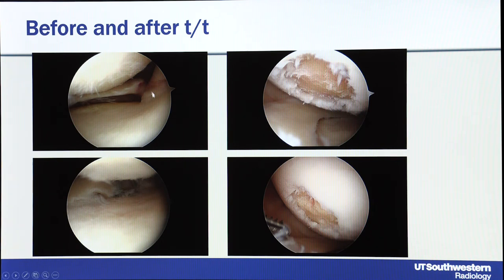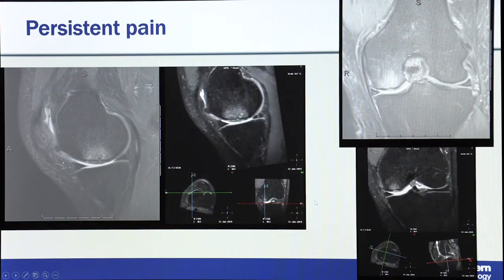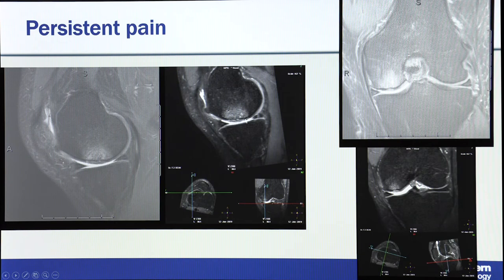Here is how it looked on arthroscopy before and after treatment. There was a posterior root tear being repaired and hyaline cartilage damage in that area. After shaving and microfracture, the patient presented with persistent pain. Much of the area looks better now, but there is still a cartilage flap with a fluid cleft extending underneath the meniscus and cartilage, quite a bit of bone marrow edema, and bone irregularity where drilling was done.